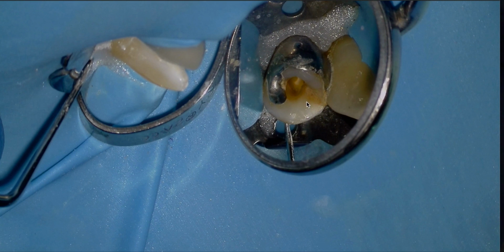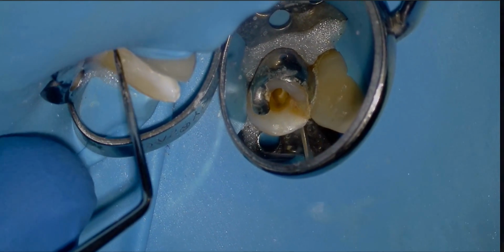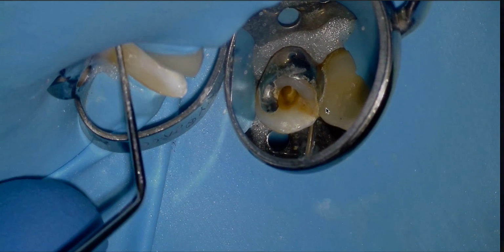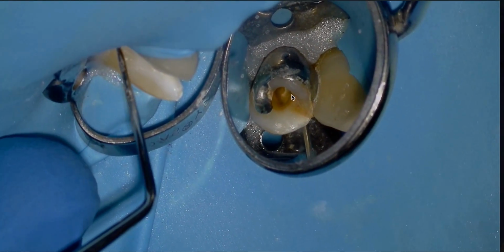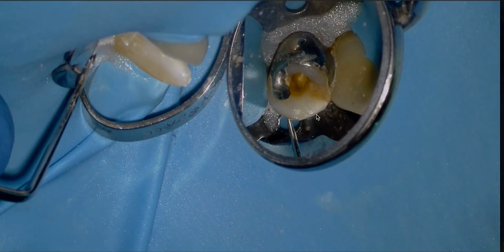And actually I was asking Angela if she could see my explorer through the screen, because this video gets played through the screen through my computer, and I'm really looking intraorally. There you can see my explorer. Watch it right here. I'm looking to see the shadowing of my explorer. That's really what I'm doing, because I'm trying to determine whether we need to put a post in this tooth or not.